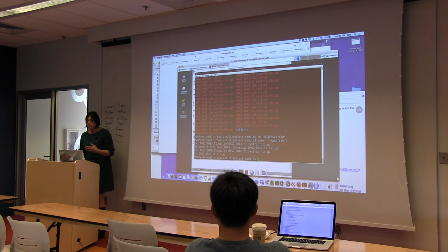So that's helpful because if you modify something, sometimes we have problems, for example, that you need to reconvert the DICOMs or the PAR/REC or something like that. We're a Philips site because one of the conversion processes didn't work, and then you have to rerun everything from there. So this way your images will have new timestamps, and then everything will resequence from then on. Yep. So that's good. We talked about doing it in parallel. Let's look at that secondary issue here.